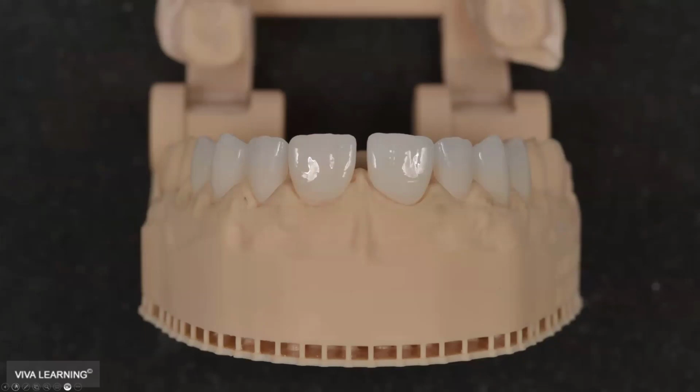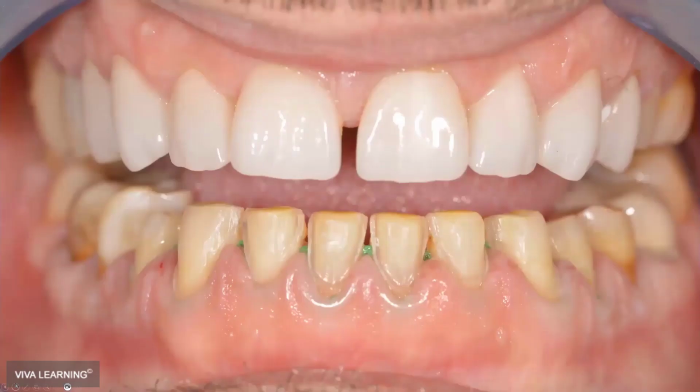Here we have the veneers on the printed model. We do the same technique on the lower ones.